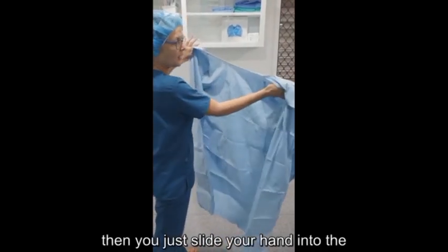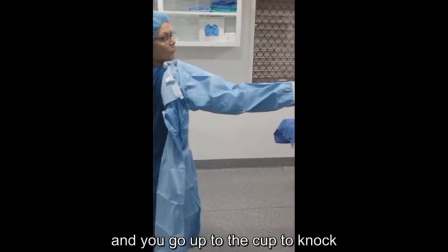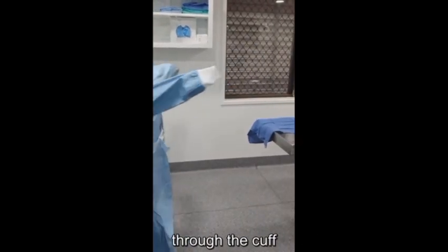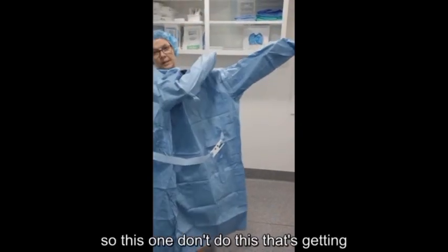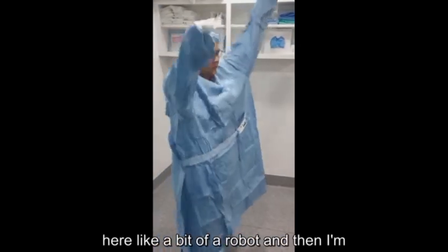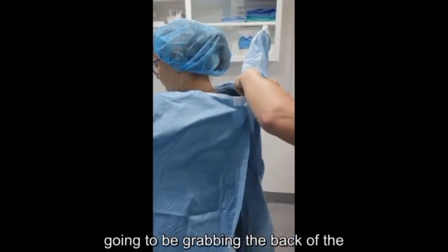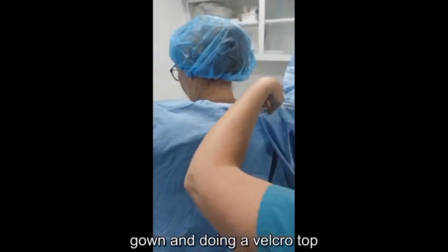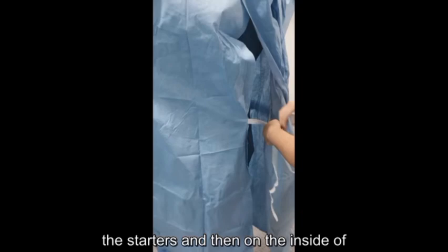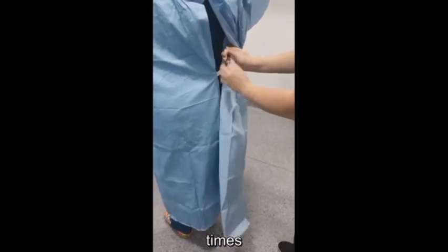Then you just slide your hand into the arm and you go up to the cuff but not through the cuff. And this arm. Don't do this. That's getting too close to the non-sterile. Just stand here like a bit of a robot. And then I'm going to ask Emily to do me up. So she's going to be grabbing the back of the gown and doing the Velcro top, and then the ties on the inside of the gown at the back.